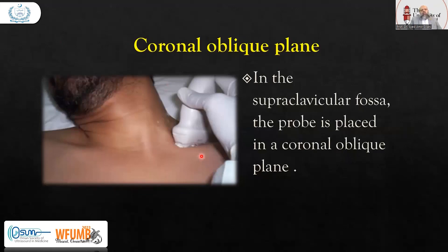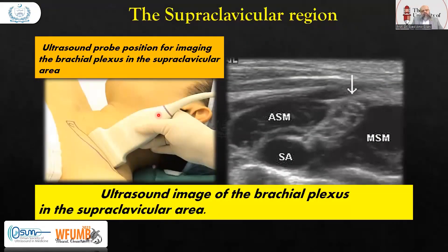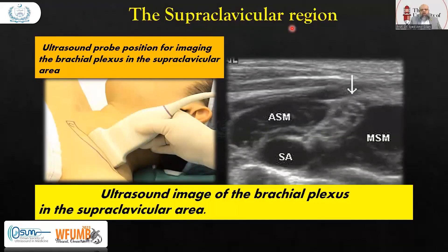Then we move the probe to the coronal oblique plane. If the neck is like this, the probe was transverse — now we rotate it to a coronal oblique orientation. In the supraclavicular fossa — above the clavicle — the probe is placed in a coronal oblique plane. Here is the clavicle, and we are looking behind it from the supraclavicular region to find important nerves.